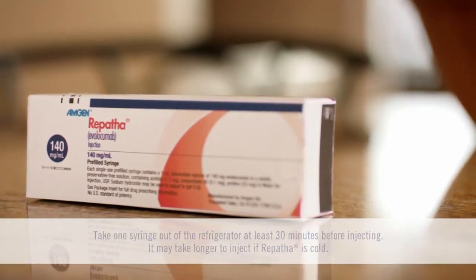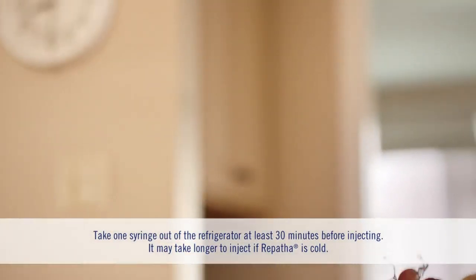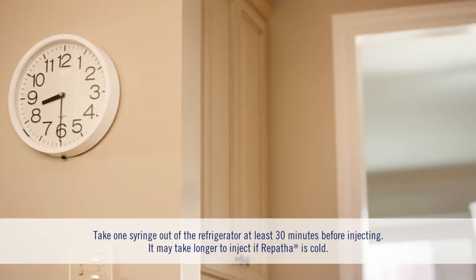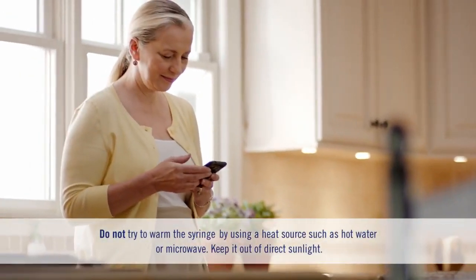To start, take a syringe carton out of the refrigerator at least 30 minutes before injecting for a more comfortable injection. Let it reach room temperature naturally — it may take longer to inject if Repatha is cold. While you're waiting, you can spend the time catching up on the things you want to do.